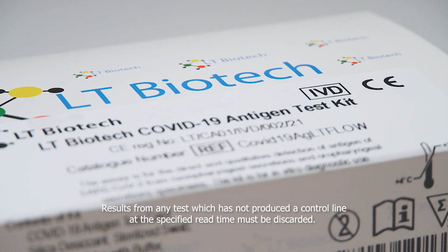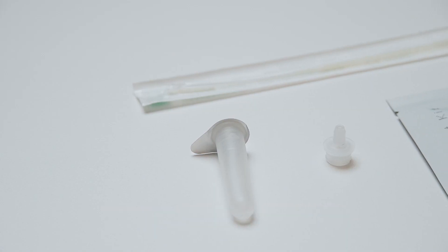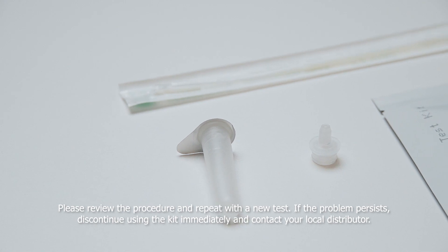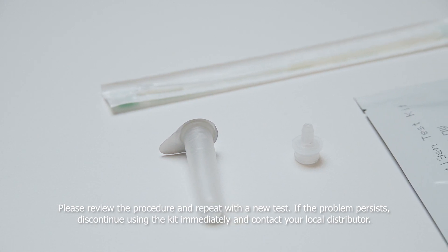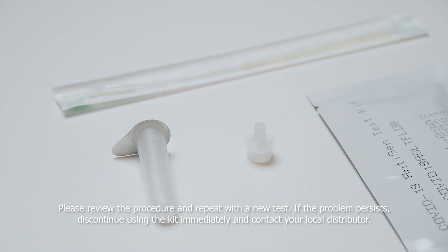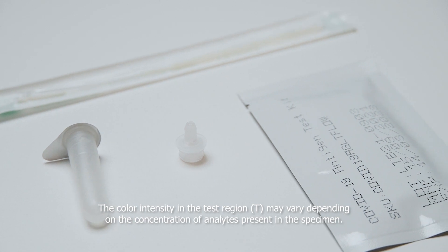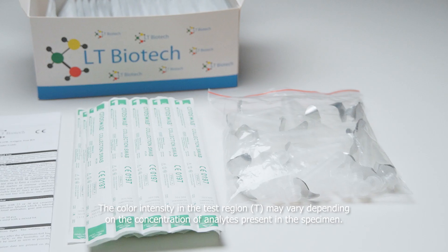Results from any test which has not produced a control line at the specified read time must be discarded. Please review the procedure and repeat with a new test. If the problem persists, discontinue using the kit immediately and contact your local distributor. The color intensity in the test region may vary depending on the concentration of analytes present in the specimen.